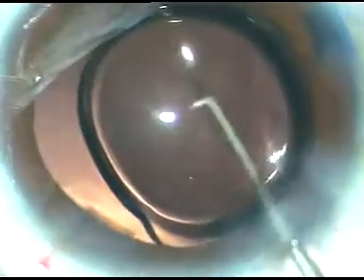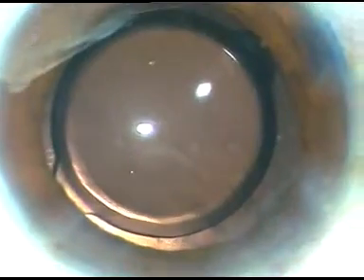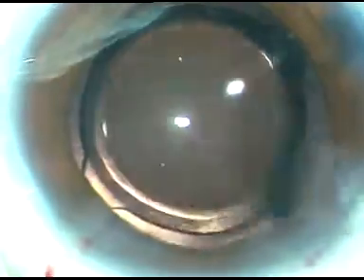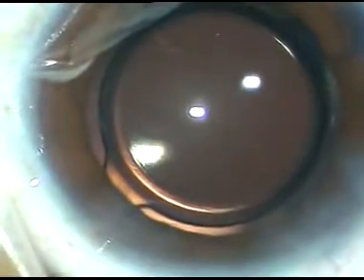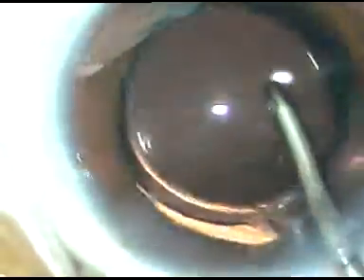The intraocular lens - this is a hydrophobic acrylic aspheric intraocular lens - has been placed in the capsular bag. I am expressing some viscoelastic substance. Now I am going to demonstrate removal of viscoelastic substance. Using the Simcoe cannula to irrigate the anterior chamber and removing a lot of viscoelastic, going behind the IOL, irrigating the space behind the IOL - that is the capsular bag - and removing a lot of viscoelastic substance. Now using the irrigating probe and removing remaining viscoelastic substance with irrigation aspiration together.